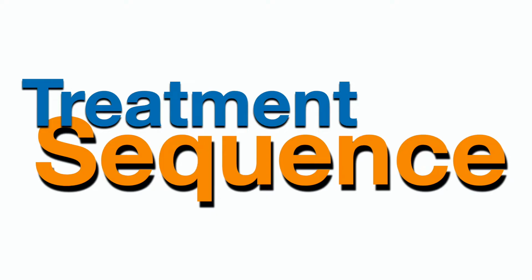And the third factor is, this person had this 10 years ago in Europe, and is the implant company still around? Or can we even get parts for a new abutment, new crown? There are now 250 implant manufacturers worldwide. With the pandemic and whatnot, how many will survive? And can we get the parts? So if you can't even get the parts for some of these implants, that in itself says it's time for removal. So let's take a look at our treatment sequence.